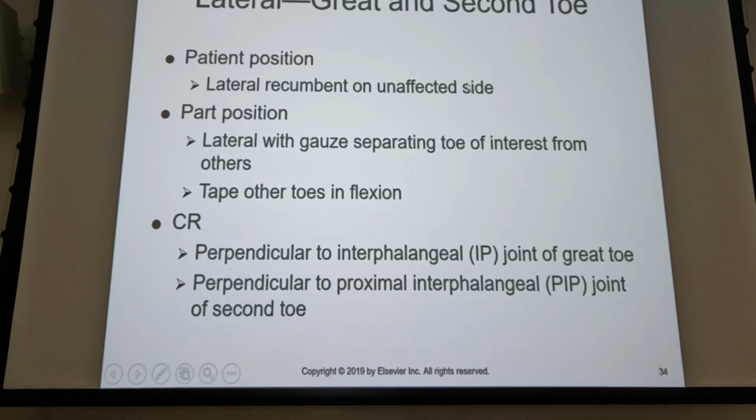Okay. So for toes, lateral toes, we will do individual lateral toes, if at all possible. And this is going to be kind of painful for the patient. So what you might want to do is look at your AP, and then put them in charge of getting other stuff out of the way.